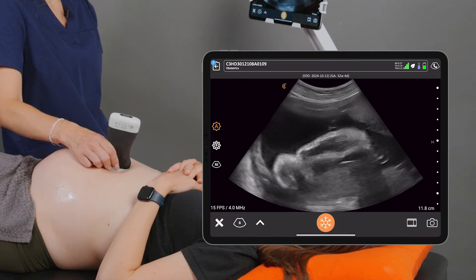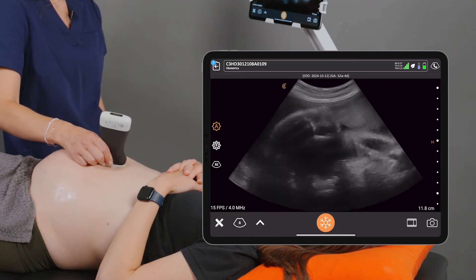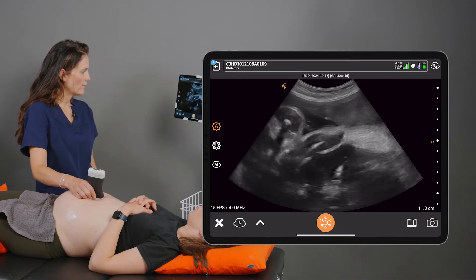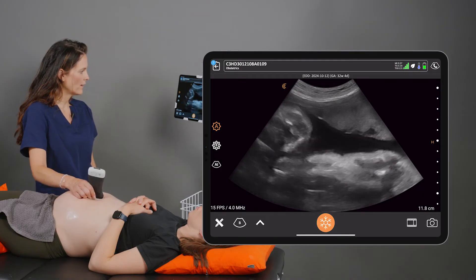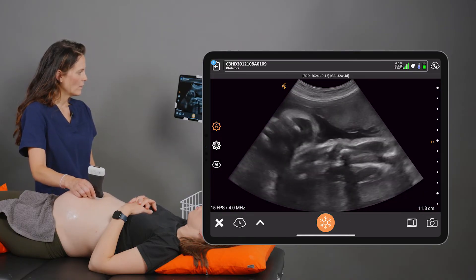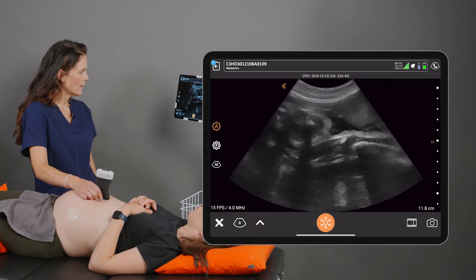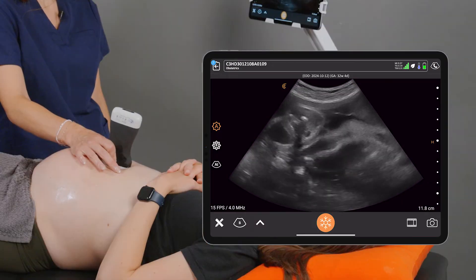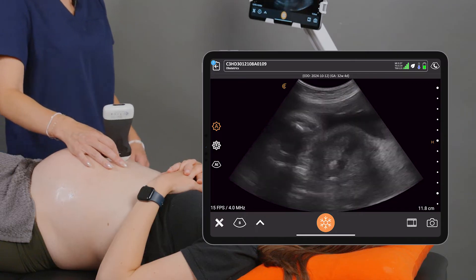For the fetal tone portion of the scan, we want to see a flexion and extension of either the arm or leg — we just saw a really big movement of the arm — or an opening and closing of the baby's hand. We'll come back to that.